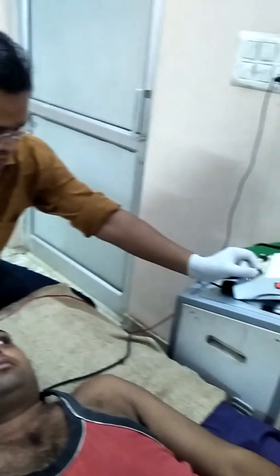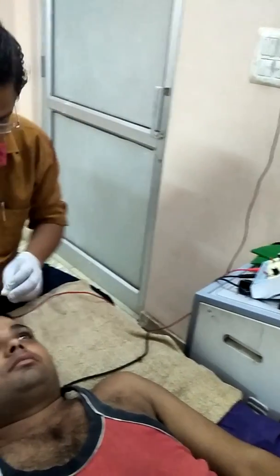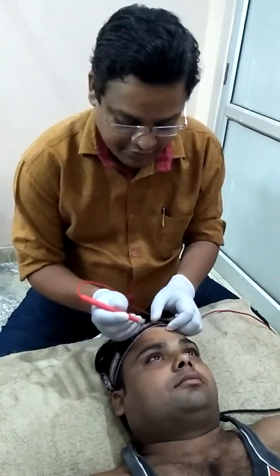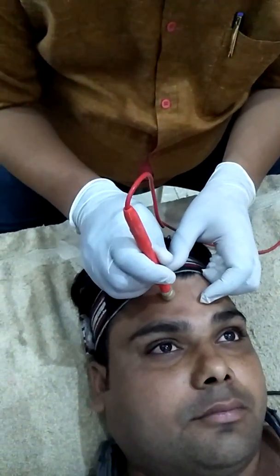First, stimulate the motor points of the facial area. Wash or rinse with a spirit swab or any antiseptic. Put the pen electrode in the first area, called the frontalis, add it on this, frontalis muscle.